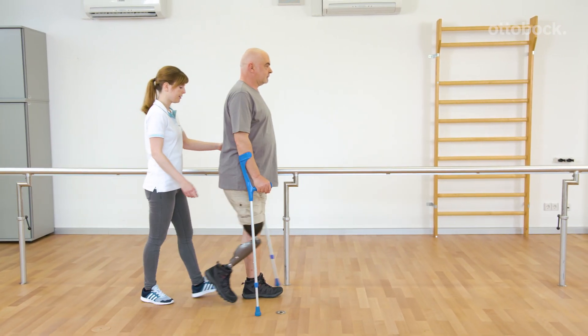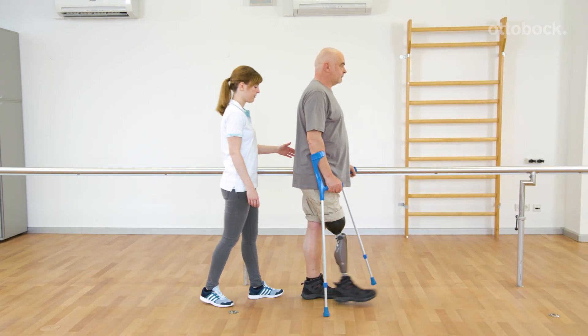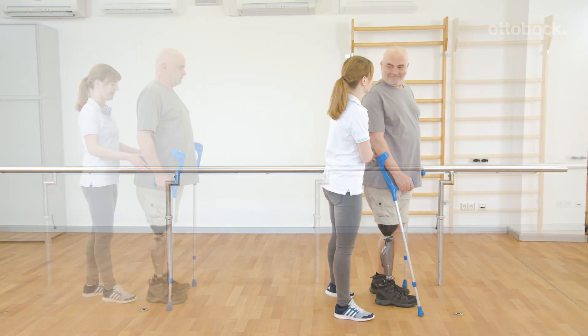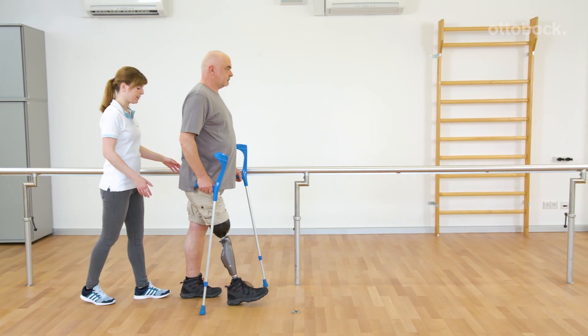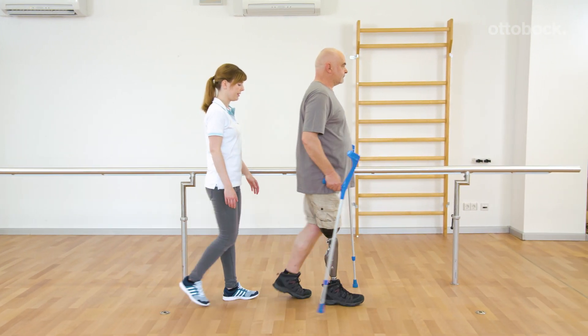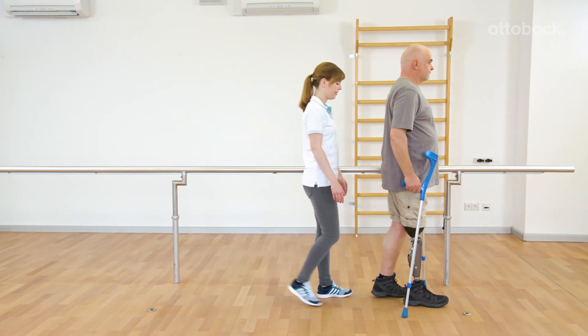Three-point gait, where both walking aids are simultaneously moved forward, is not shown since it is not recommended for use in prosthetics. The entire weight is placed on the walking aids and the prosthesis is not loaded. That could affect the functionality of the knee joint.